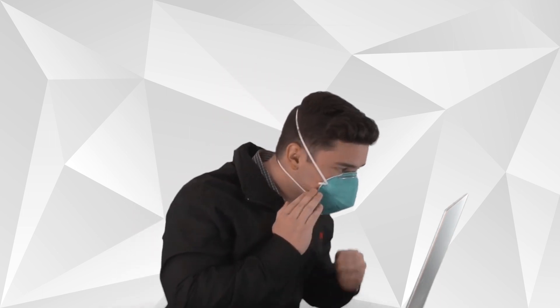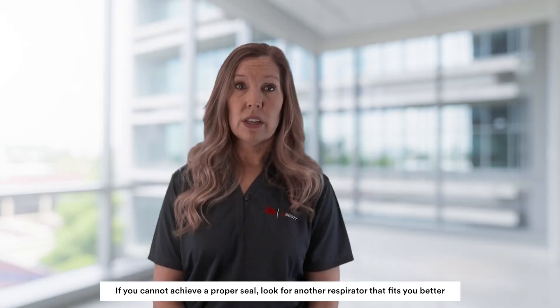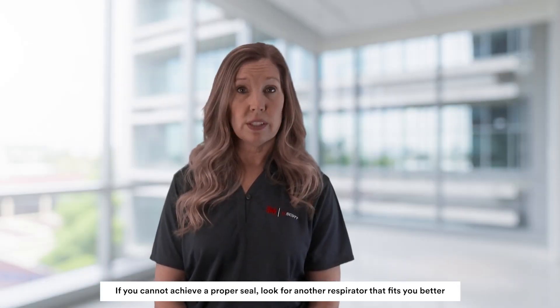Check the fit in the mirror or ask a friend if you have donned it properly. Check the seal by covering the respirator surface with both hands and inhaling and exhaling sharply. If you feel air leaking around the edge, adjust the fit, or if you can't get a good seal, look for another respirator that fits you better.